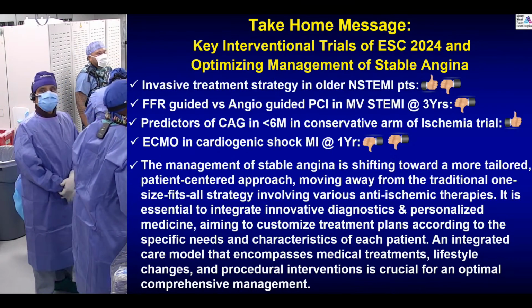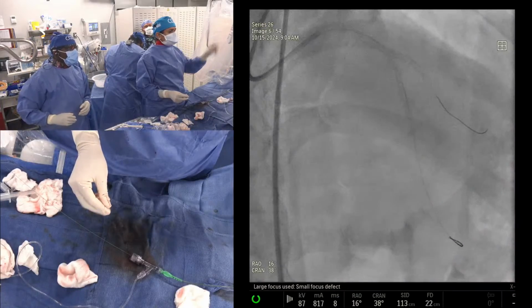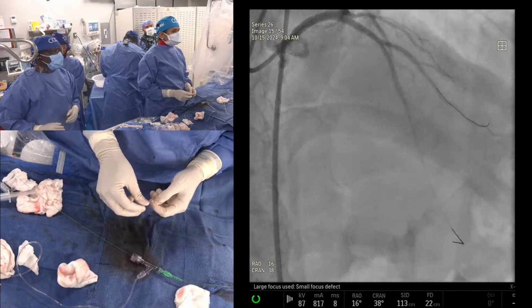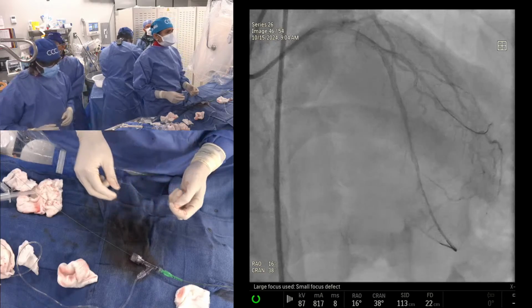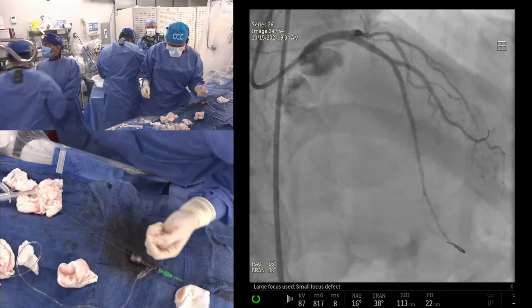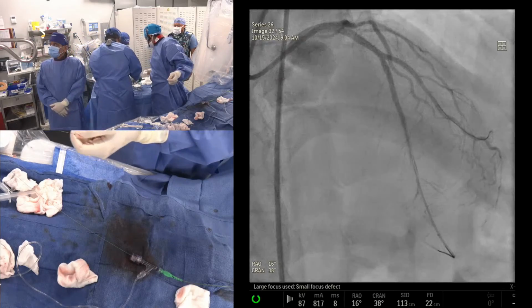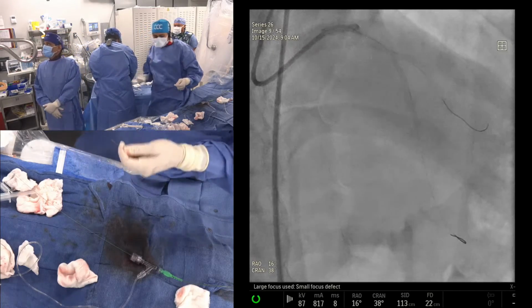Now there's a dissection in the distal, because one of the, see there, we can just do with the balloon. Yeah. Long balloon. The diagonal looks absolutely fantastic. So you want to go step by step. Yeah, no, I can go crush, but let me put a balloon there. Yeah. Now we are going to get me a new balloon for a long time.